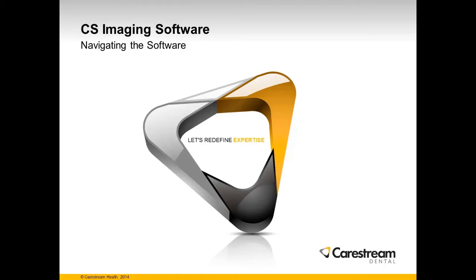This beginning level recorded class is titled Navigating the Software. It's designed for clinical team members new to CS Imaging Software, version 7.